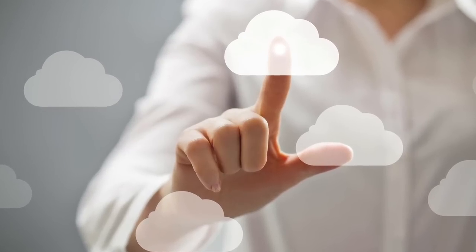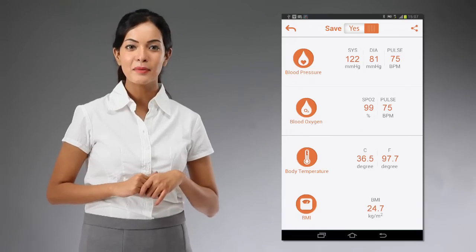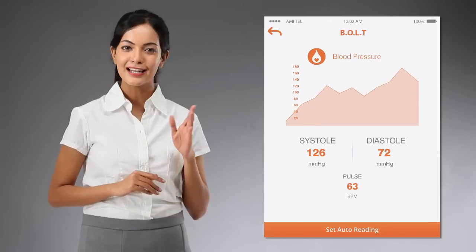Once you are done with the test, you can check your health status in detail, monitor the history in the trends, and the records can be uploaded to the cloud. The health data can be shared with your physicians and loved ones.